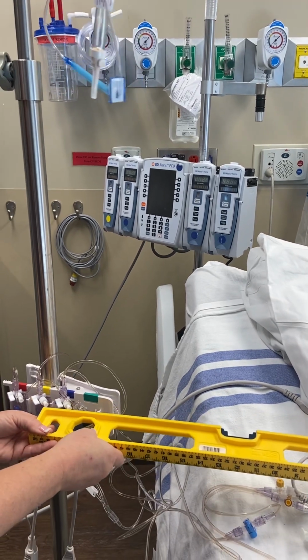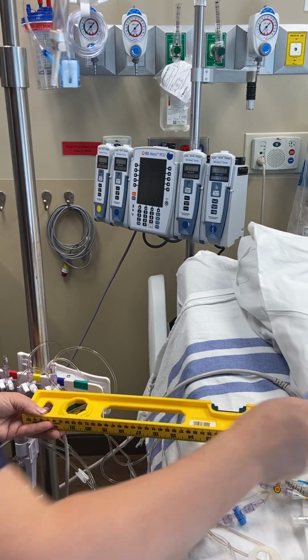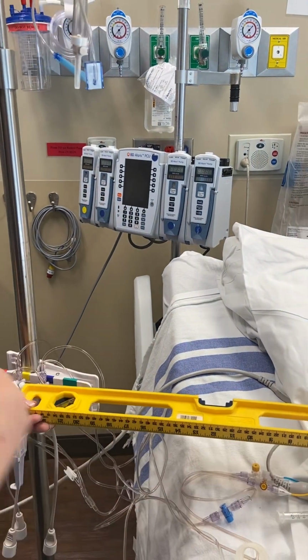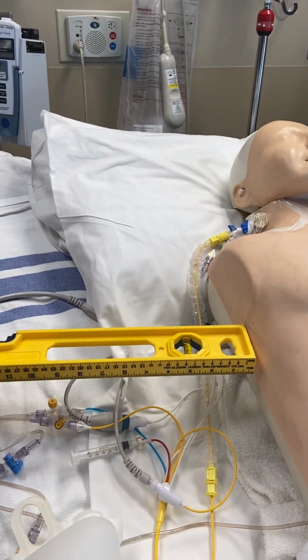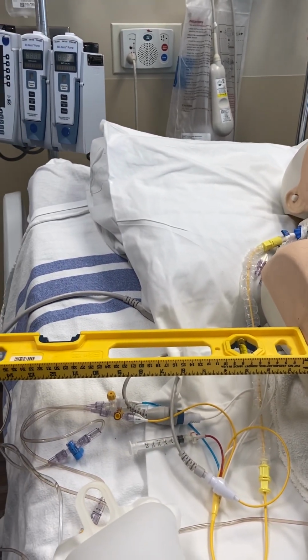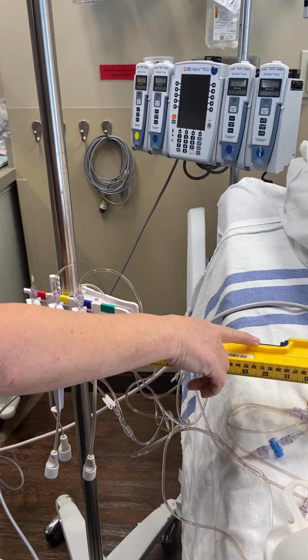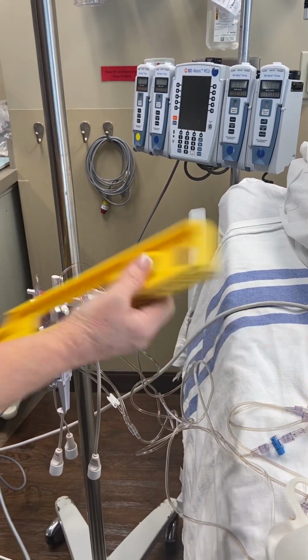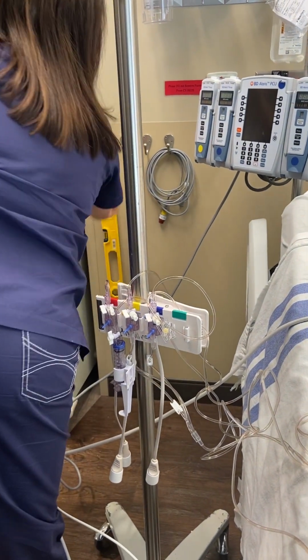So I always make it a note to mark on my patient, so that I'm making sure that the person following me is also doing the same, okay? So your transducer, your three lines should be level and zeroed with your patient once you get started. And that is just to ensure that your numbers are all correct.